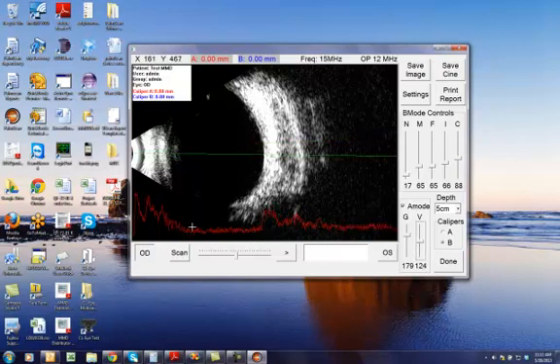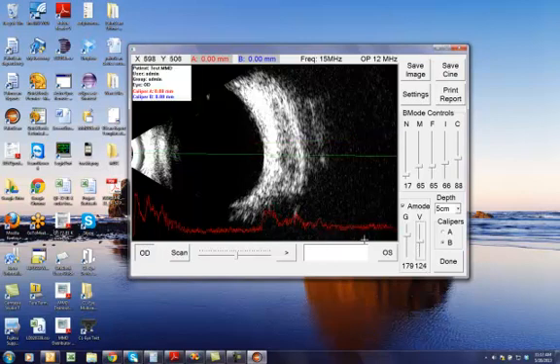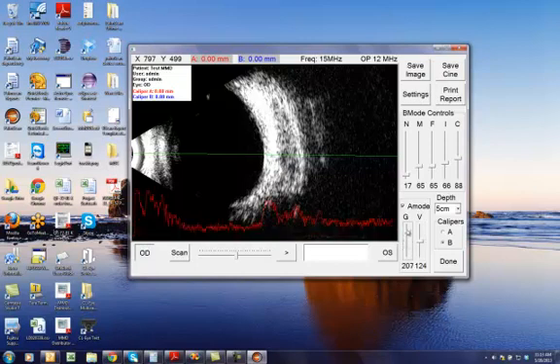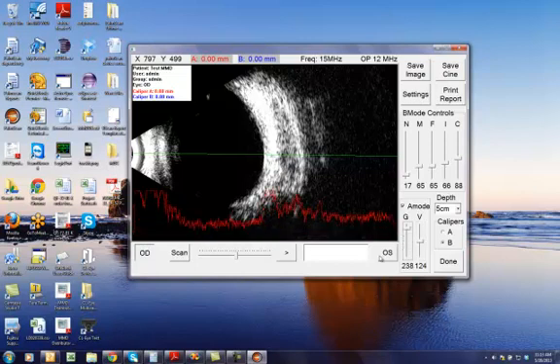And the red graph here is the information within that vector that we're looking at. The G slider is the gain of the A mode vector. If you want to see it higher or lower, you can adjust it by adjusting the gain.